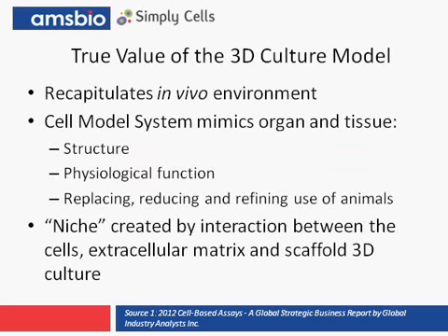Most biologists grow cells the way their advisors did it, and their advisors before them, and that is as monolayers on 2D polystyrene surfaces. But the problem with that is that the resulting data may not very accurately represent what happens in vivo. After all, cells in our body grow in complex 3D structures, and that impacts their cell morphology, behavior, as well as gene expression, physiology, and drug responses. All of these factors can make a big difference in the relevance of the model.